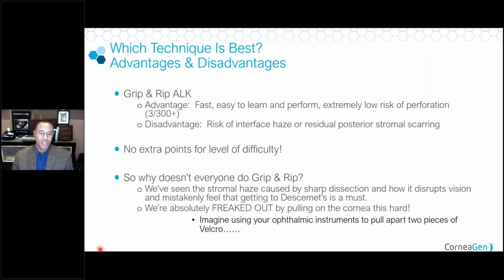I'd rather go straight to PKP. And in all honesty, people are really intimidated once they see this procedure. So I really like to take that down and tell you that it's not nearly as difficult or as scary as it may look when you see it, and hopefully get you over the hump to say, hey, this is something that I want to try. Next slide.